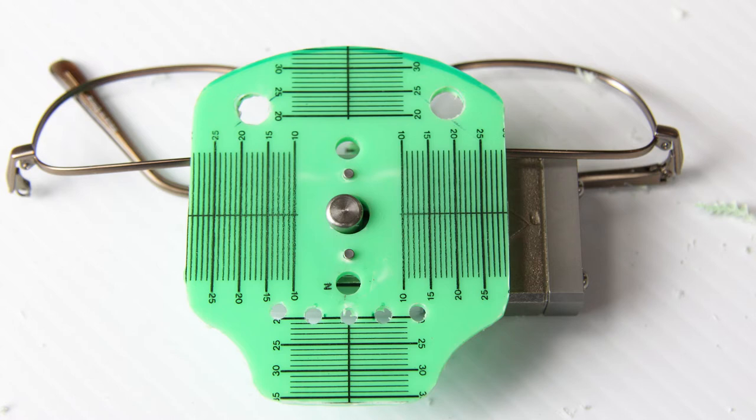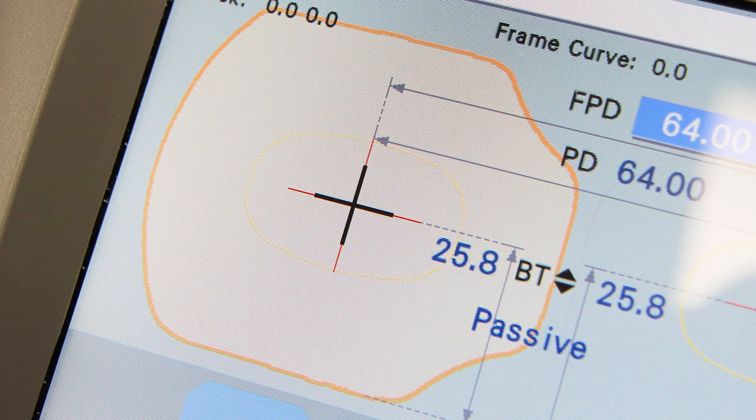Now, the reason I'm using a pattern rather than trying to do this with individual lenses is because I want consistency. I want to be able to duplicate the shape over and over again in case I ever wanted to use it again. Obviously, I could keep this pattern around if I had an old edger. Of course, a nice, beautiful new one lets me save this shape, and there it is, so I could actually recall it again anytime I wanted to.